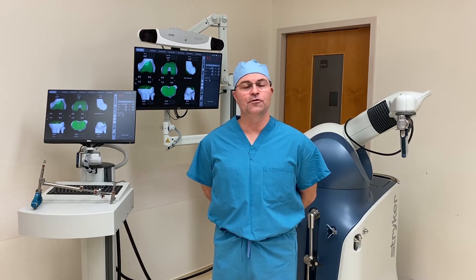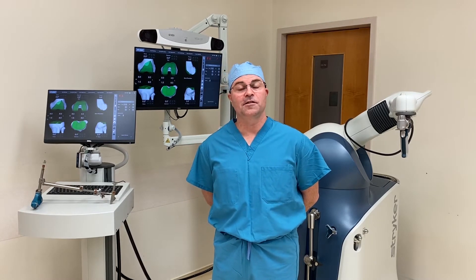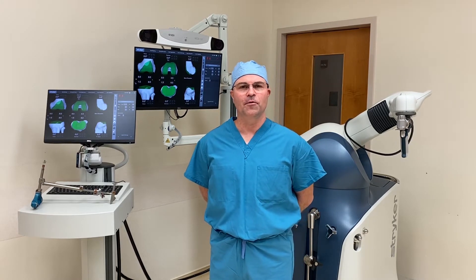This is a tool that I use that allows me consistent precision that's simply not possible using standard instrumentation. The MAKO Robot is a 21st century tool made for 21st century knee replacement.